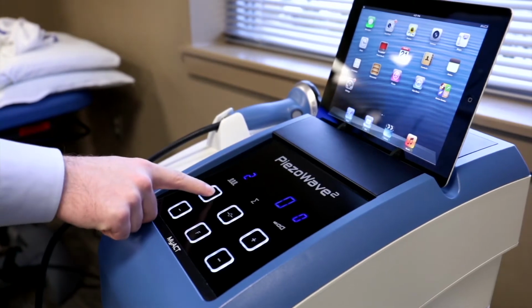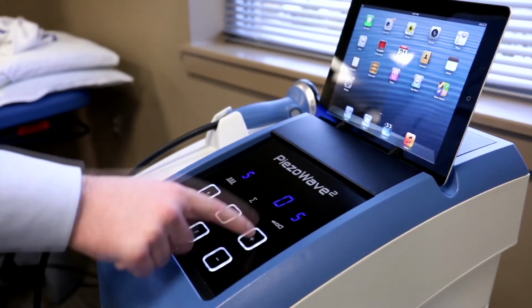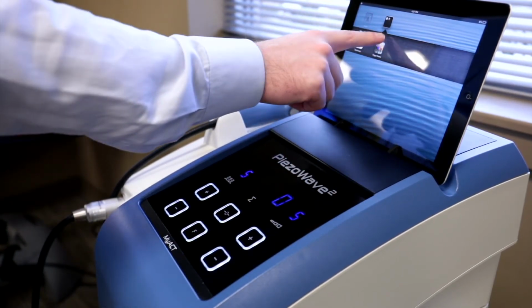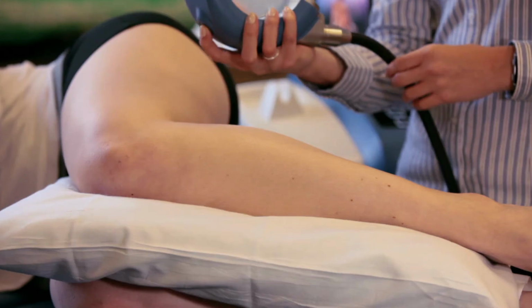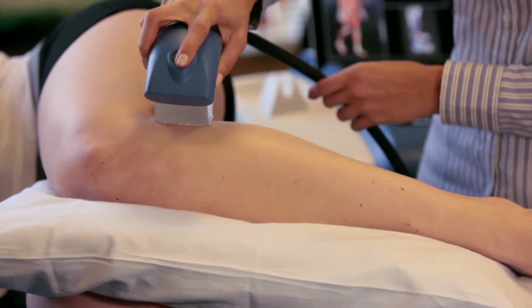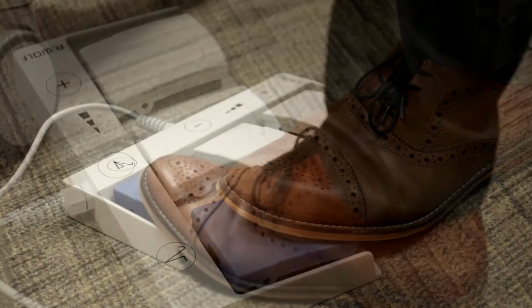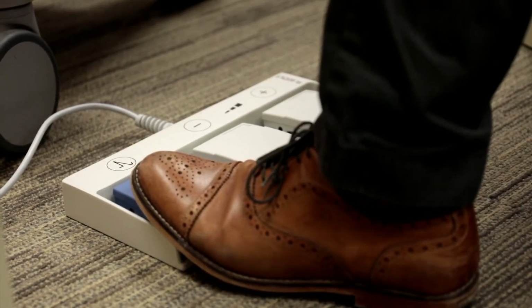Turn the control unit on. The plus and minus buttons on the left and right side of the control unit control pulse speed and intensity respectively. An iPad fits onto the control unit for protocol reference and patient instruction. To initiate therapy, press the button on the therapy source or press the colored pedal on the foot switch. The foot switch also allows you to adjust the intensity of the pulse up or down.